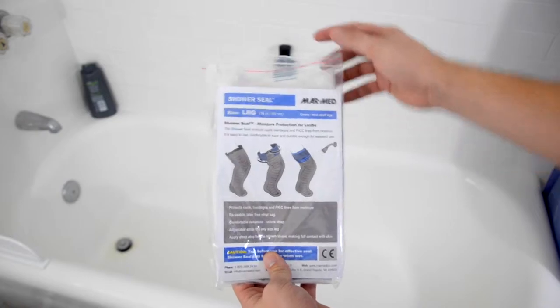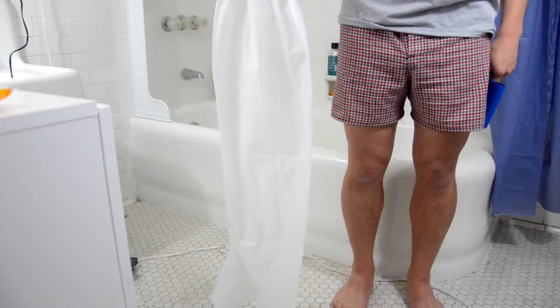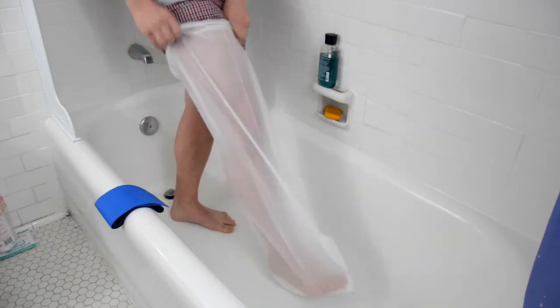Remove the Shower Seal from its plastic storage pouch to unfold the vinyl bag and neoprene velcro strap. Place your arm or leg in the latex-free bag to cover the affected areas.